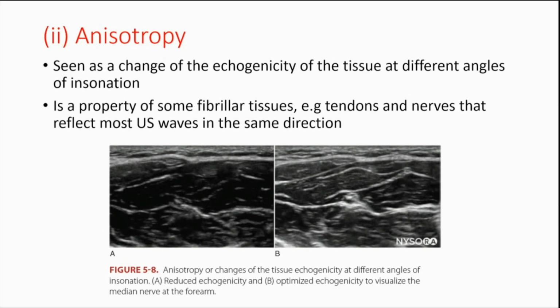So if you put the probe at the vessel and then tilt it, you can actually get the directional flow towards or away from the probe. Then you put on the color, and you can see whether the color fills up the whole lumen, or whether it does not fill up the whole lumen and there's an echogenic area within, which would be a thrombus.